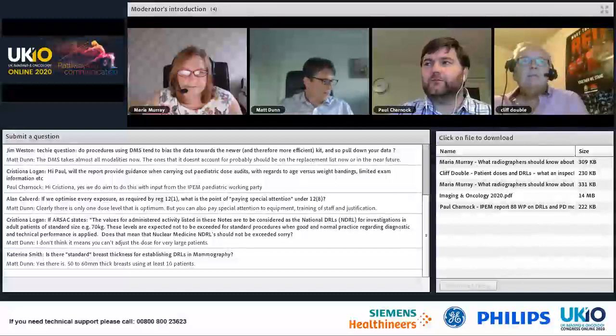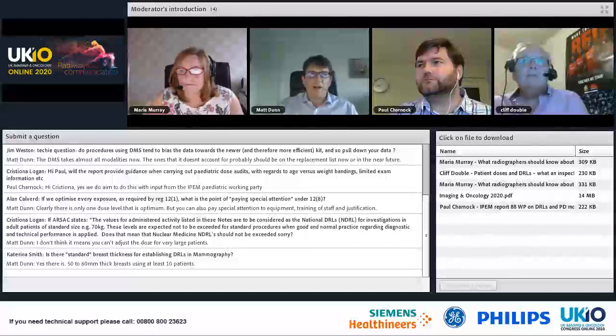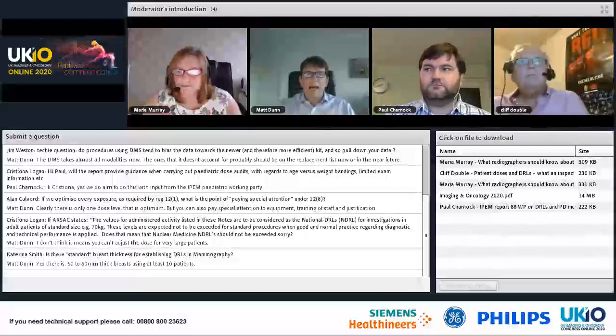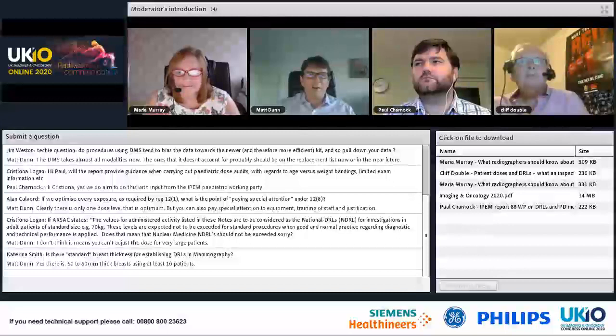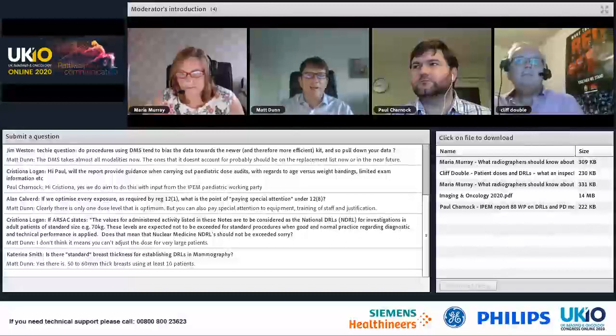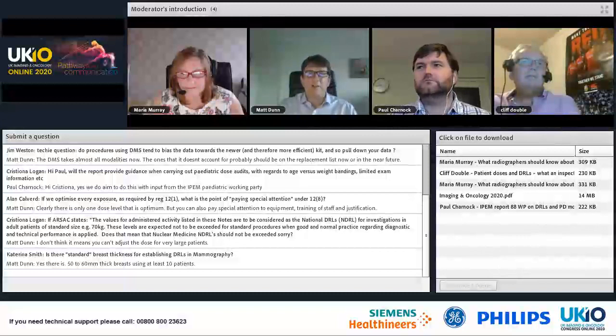Okay, thank you. So then there's a question about dose management systems from Paul Connolly. I think Paul's comment really is about the fact that the manufacturers are selling dose management systems with lots of bells and whistles. And do the panel think that perhaps some of the bells and whistles are detracting from the main purpose of them, which is really to support dose monitoring and optimization? My personal view is that some of the bells and whistles are a distraction. Certainly in Nottingham, we have an awful lot of systems connected to a dose management system, but actually the basic data is what we're really using mostly for our work. I think it's really important that you do use the system to get a measure of what your current patient doses are and to report that regularly. That's really, really important. I don't know whether any of the other panel would like to add to my comments there.